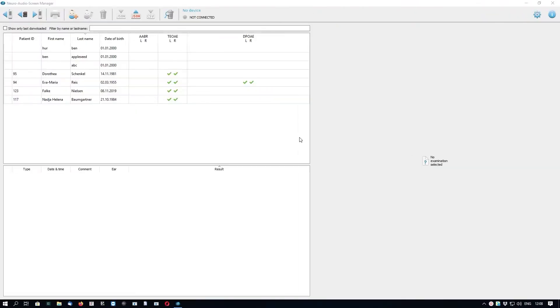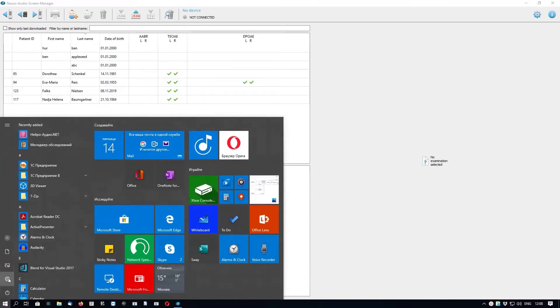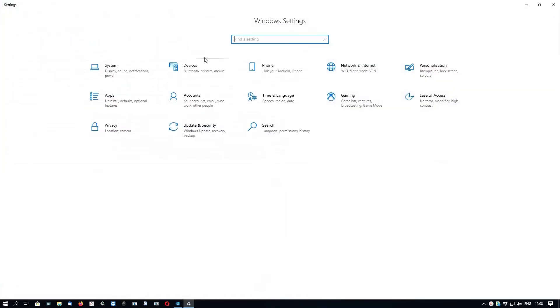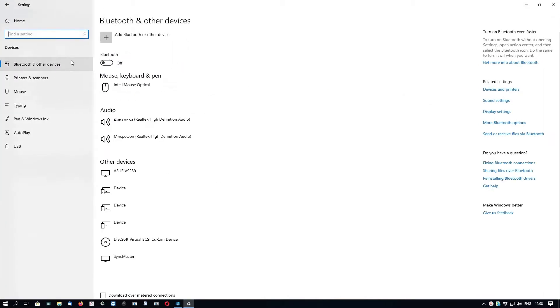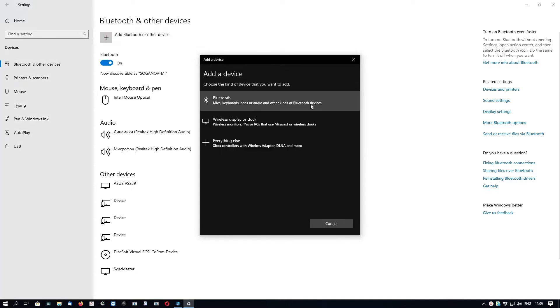For data exchange with AudioSmart device, the wireless Bluetooth connection is used. The first time we connect the device to the PC, we need to go to the Windows Bluetooth settings. We go to Start menu, Settings, Devices, Bluetooth, and we need to turn it on if it was switched off. Then we click the plus button and select Bluetooth.